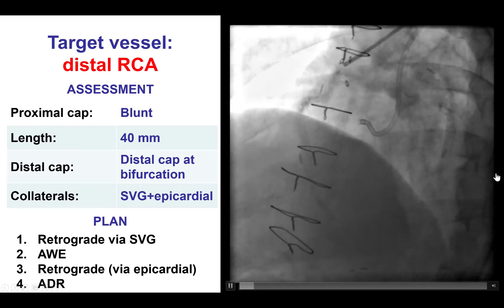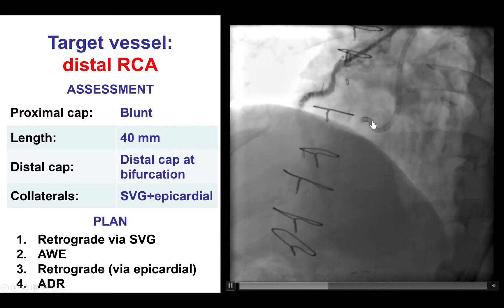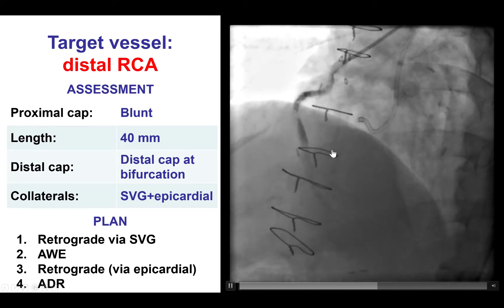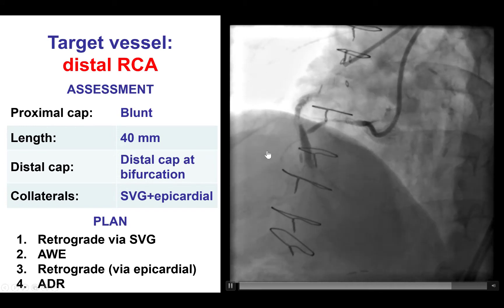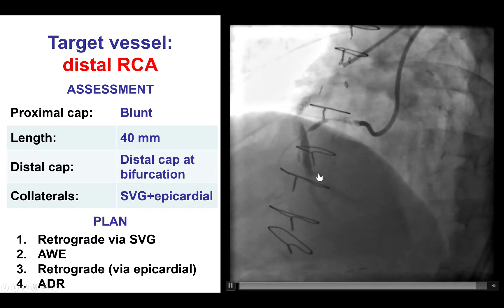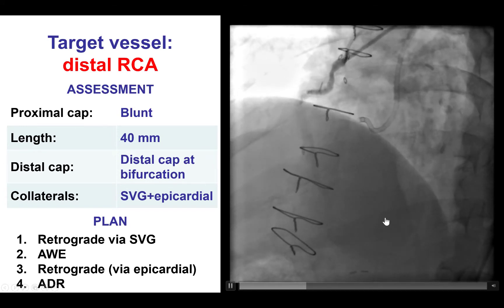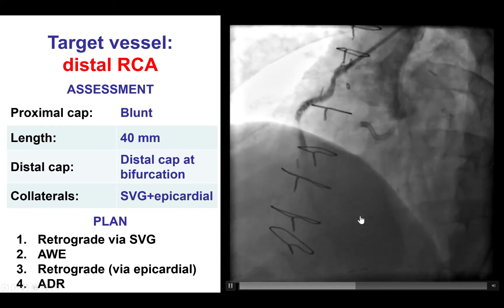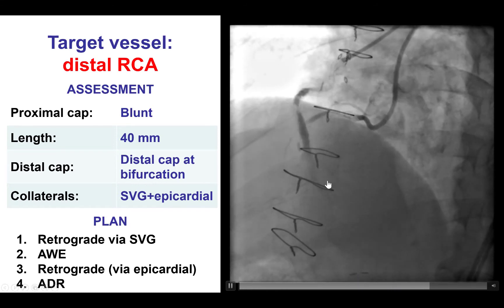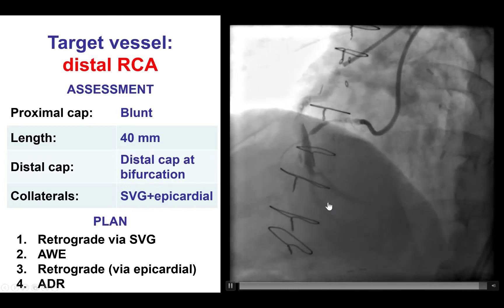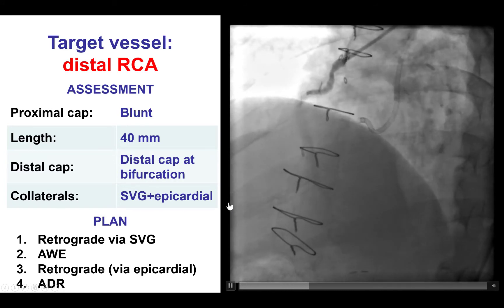We obtained dual arterial access and performed dual injection. That demonstrated that the right had a blunt proximal cap with some ambiguity. There was a length of about 40 mm. The distal cap was at a bifurcation, and the distal vessel was filling by the vein graft. There were also epicardial collaterals from the left coronary system.